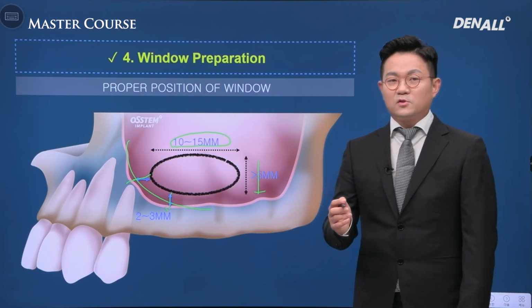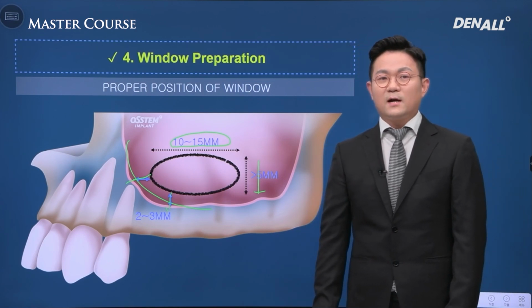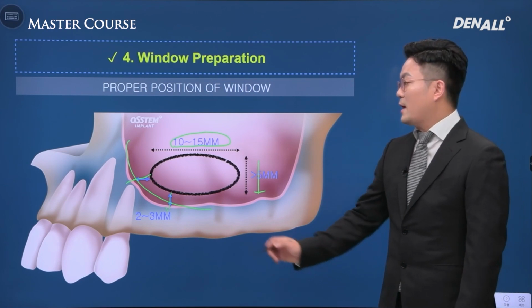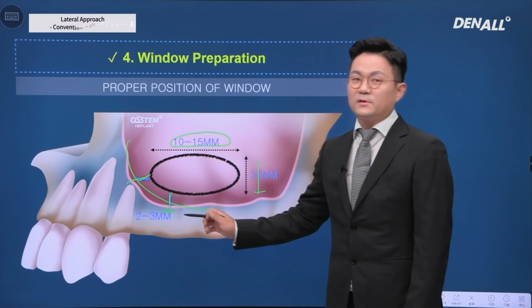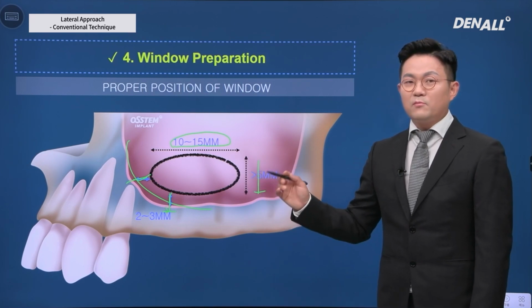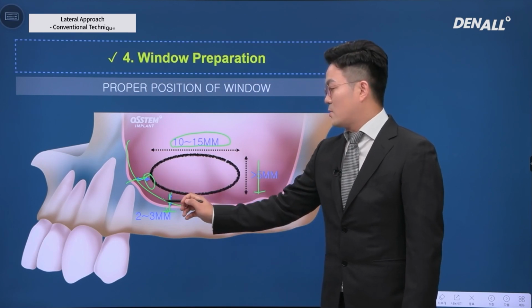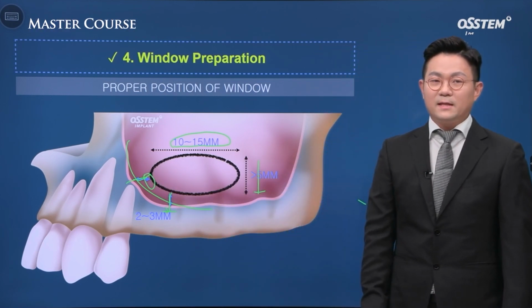Once you become comfortable, you can customize the size to your preference. But again, toward the front and closer to the inferior margin is key, because perforations on the medial side and here on the inferior side are seen a lot.